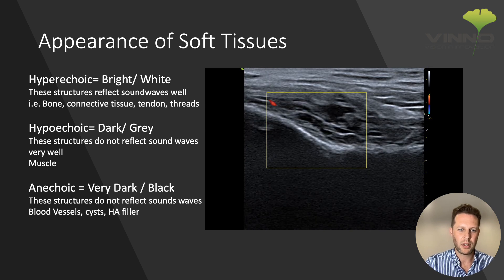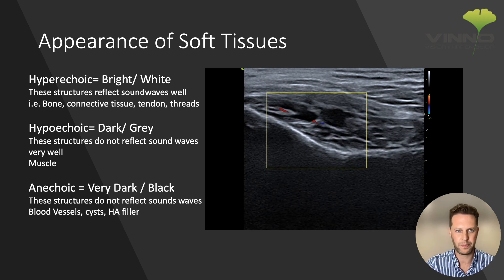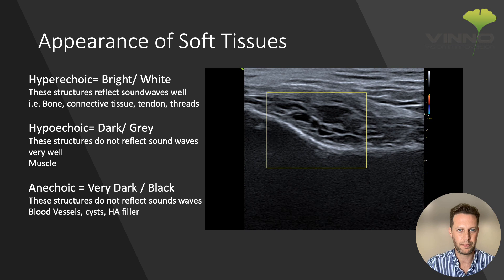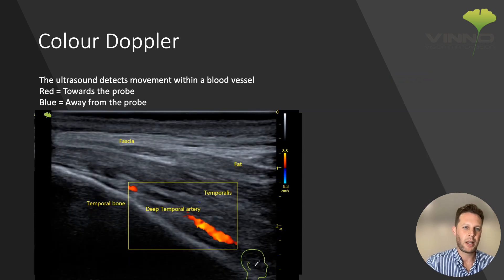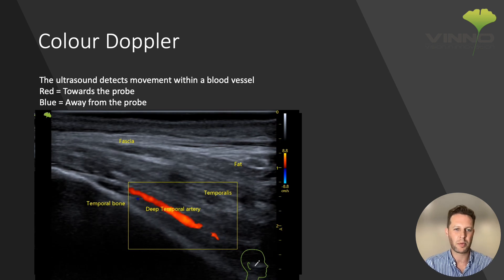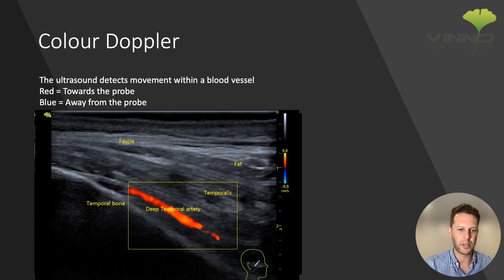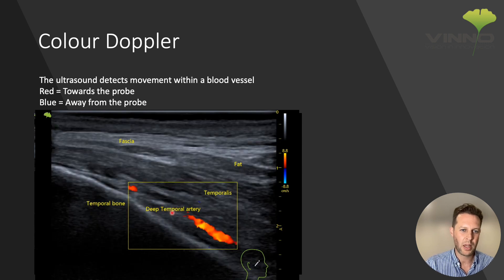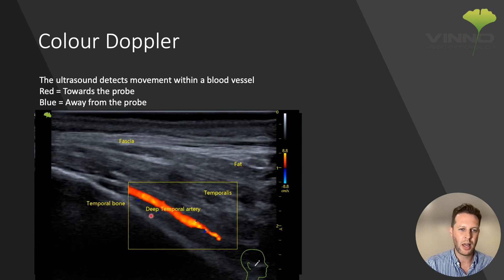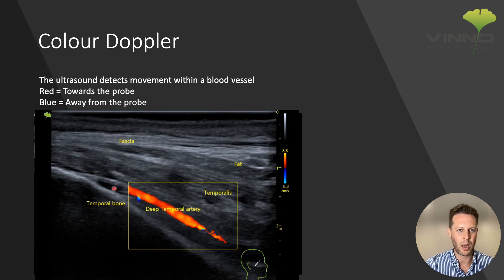The other thing we can see in this video is some colour. Colour Doppler is basically a mode on ultrasound which detects movement, so it's really useful for aesthetic imaging because it's able to pick up blood flowing in arteries and veins. Looking at the same image, we can see the deep temporal artery just above the bone. When you put colour Doppler on, you'll see all of the colour flow within the yellow sampling box.